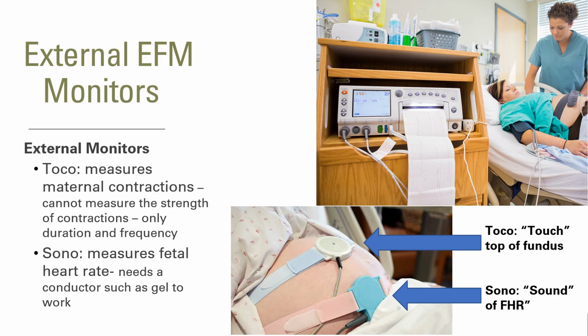Once you connect that, you'll have to zero it out using the UA reference. The TOCO itself measures the contraction duration and frequency. It does not measure the strength of the contraction because it is external, and external monitors are not precise.